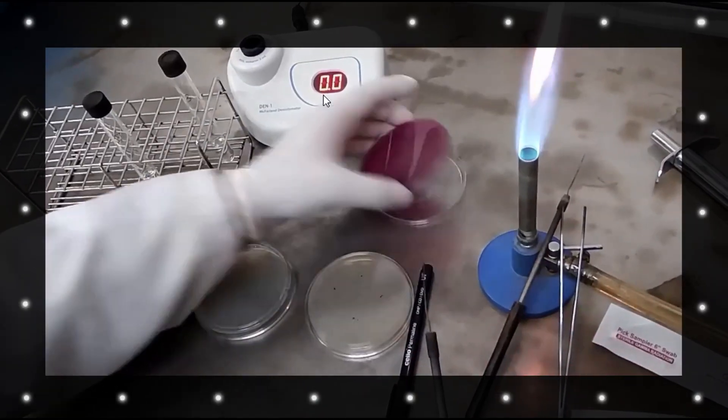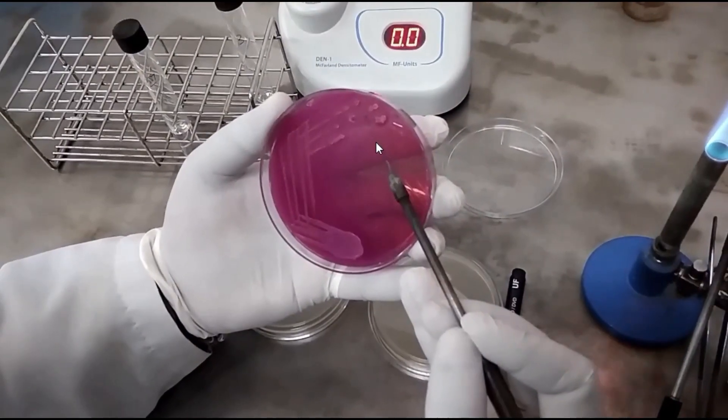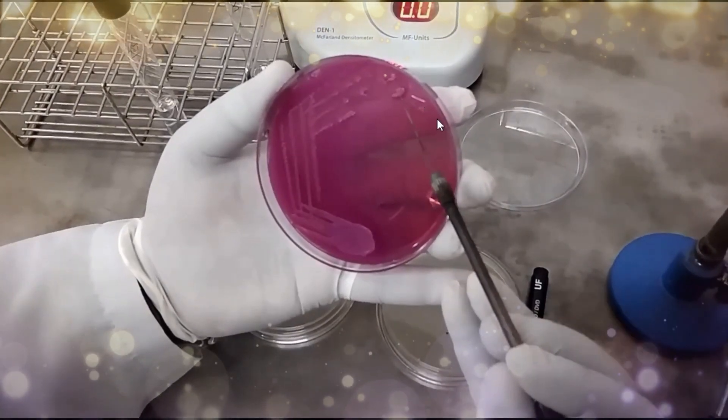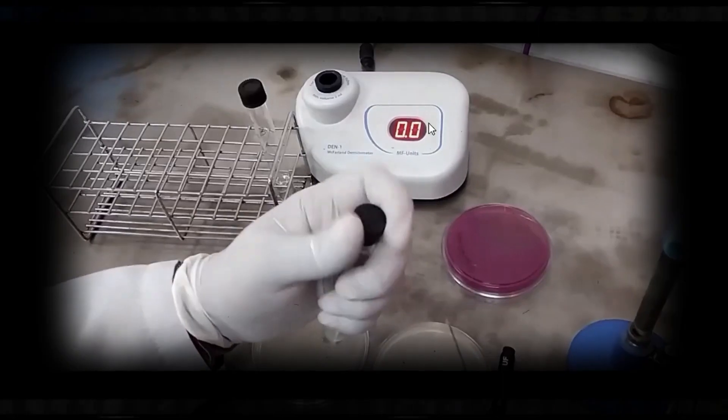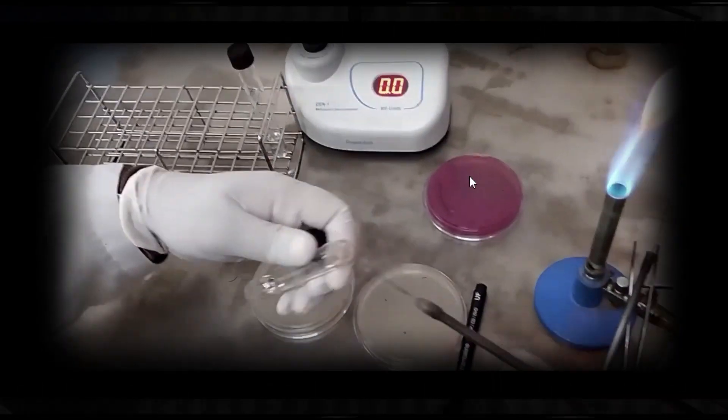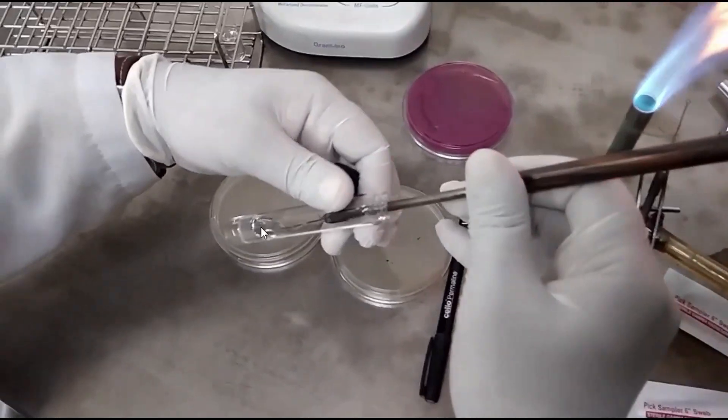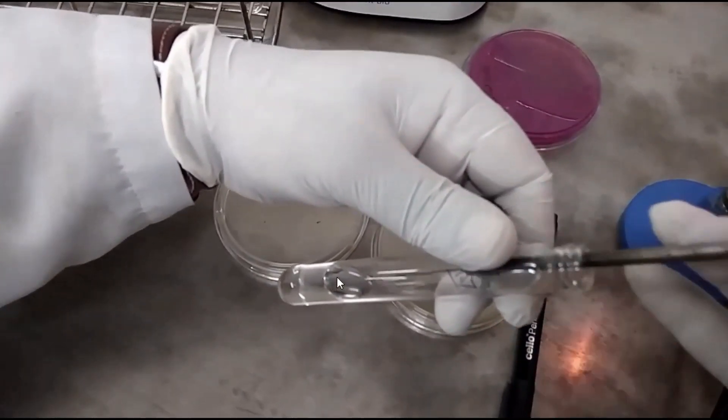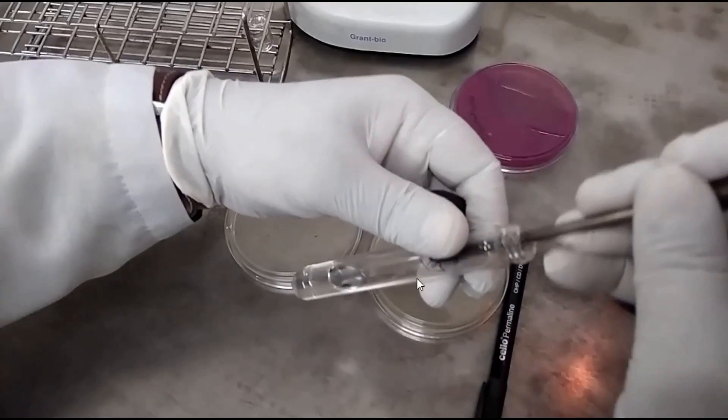Here we have the test organism in MacConkey agar, lactose fermenter colonies. The organism is gram-negative bacilli. Take two to three pure isolated colonies in this normal saline and mix properly in this way.